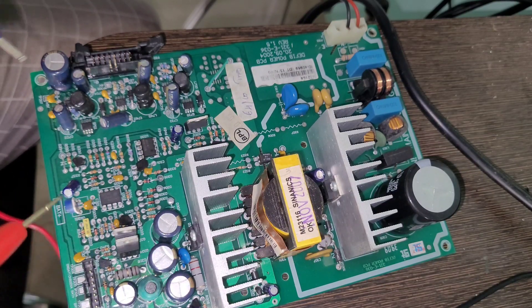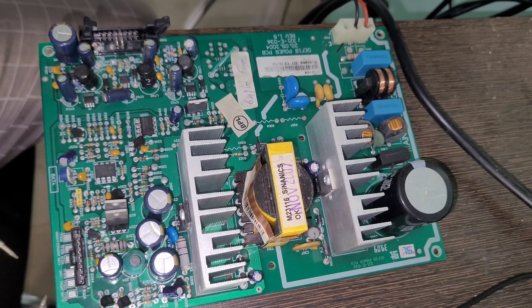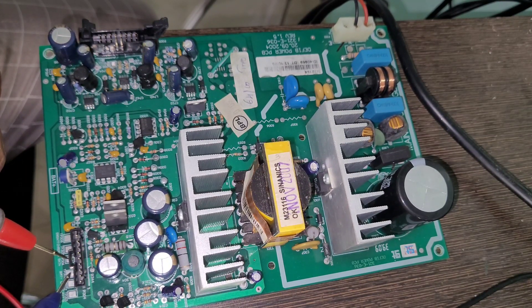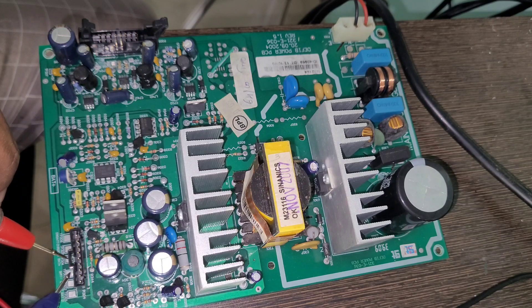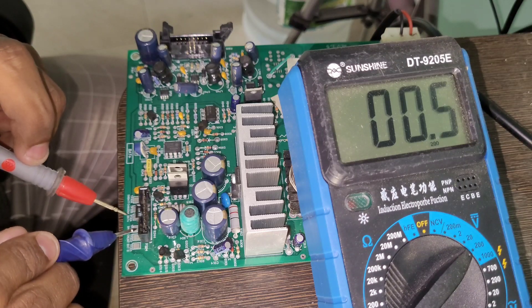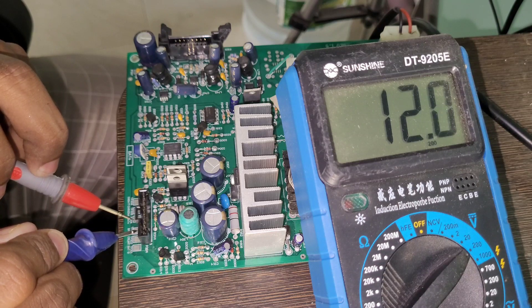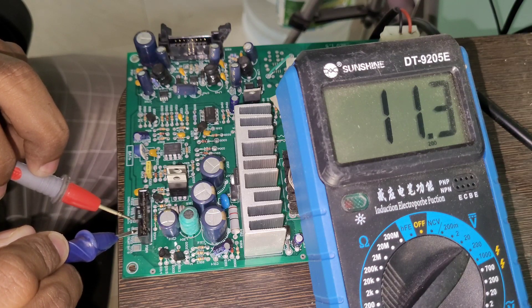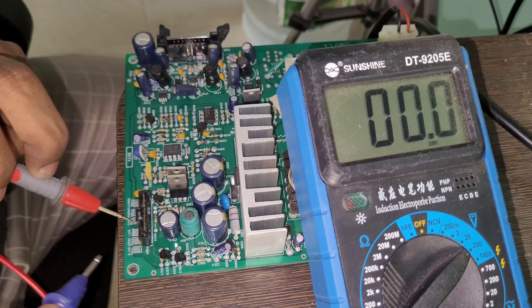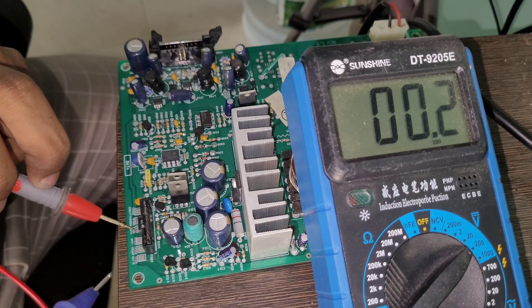I connected the phase and neutral, switched it on, and I'm checking the test points with the multimeter. This is battery minus and battery plus. I'm getting a fluctuating value — the values are fluctuating from 14 to 11 volts. So we can assume there's a problem in this circuit. Let's check other testing points to confirm whether the fault is here or somewhere else.